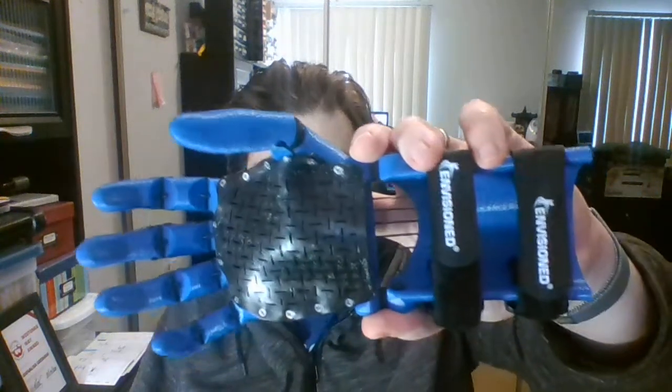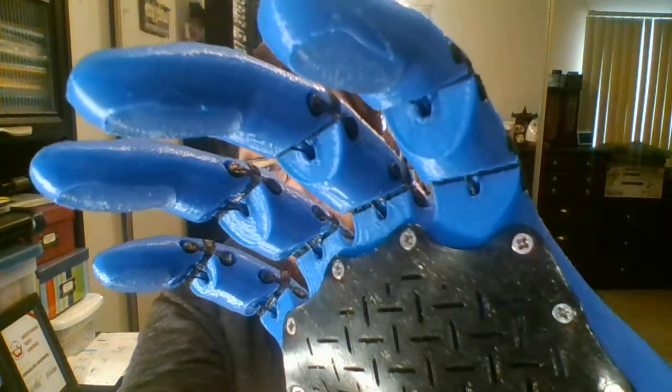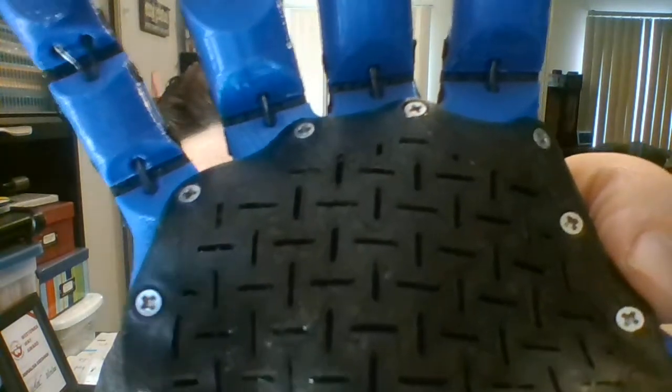Hi, my name is Dallas Gresham and this is my submission to e-NABLE for my kinetic hand from Free 3D Hands. This was printed at 70% scale. The print quality came out pretty nice, although there are a few blobs and zits on the fingers from printing all of those pieces on the same build plate. That'll have to be fixed in the future with retraction and cooling settings.